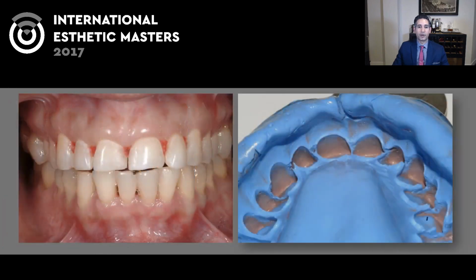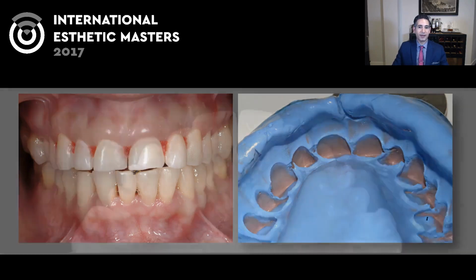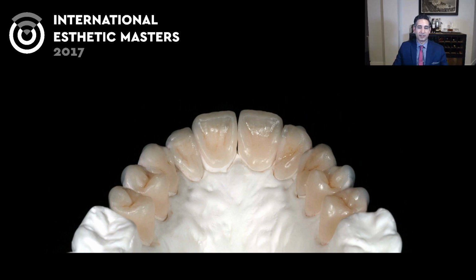So our final preparation is just that immediate dentin sealed area. We take the impression, and then we have the lab create, again, just as before, these composite restorations. And in this case, we did not only the canines, but we went up to the premolars to restore them with this composite palatal onlay, so that later, when we come back to those premolars, our preparation can be a little more conservative and not have to be more like a crown or a wraparound.